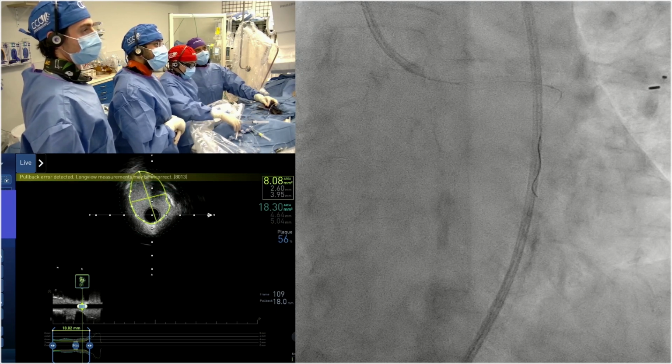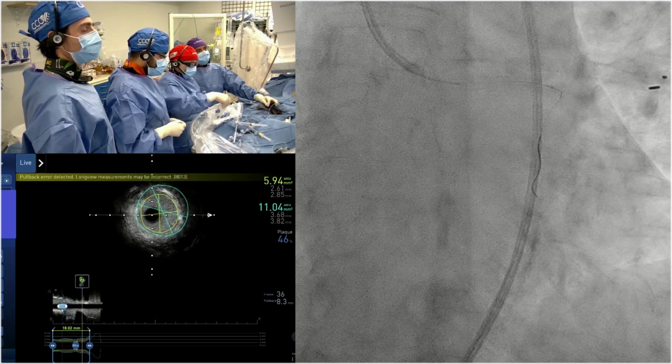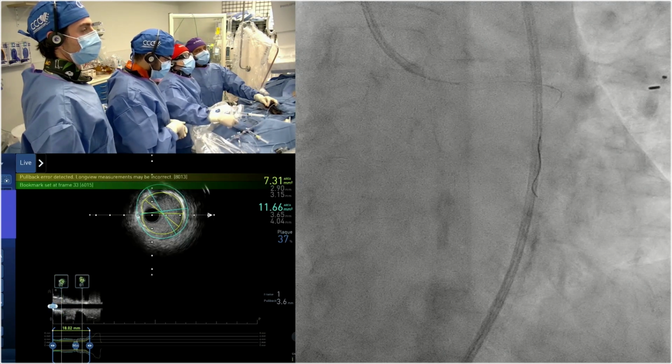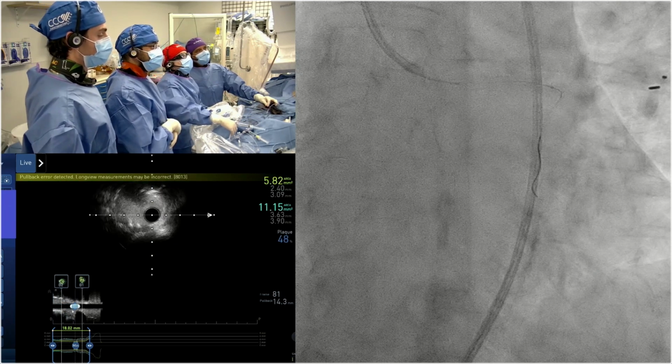Roxana, can I bring up a point about drug-coated balloons? Unlike IVL, where you can shorten the time interval, say come down to 5 seconds, if you do that with a drug-coated balloon, you can't use it again, and you just threw away $5,000.